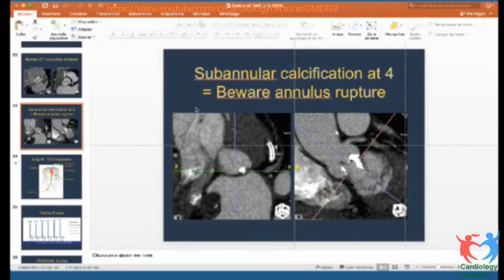Do you use any carotid filters for stroke prevention? No. I think no filter, because every time you use them, you could have complications. So if you are using them to avoid stroke and have a stroke when you are putting them in the carotid, it would be difficult to support.